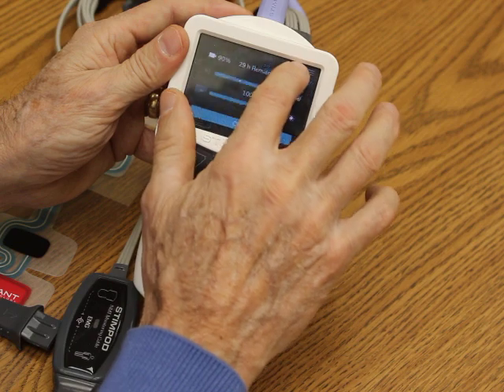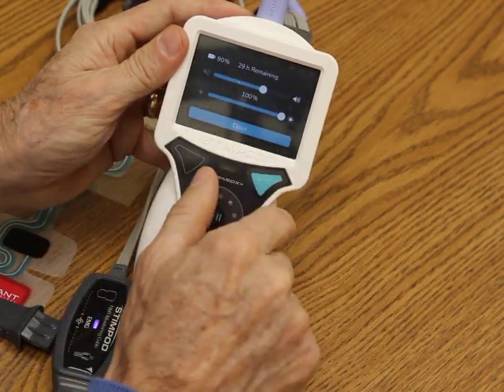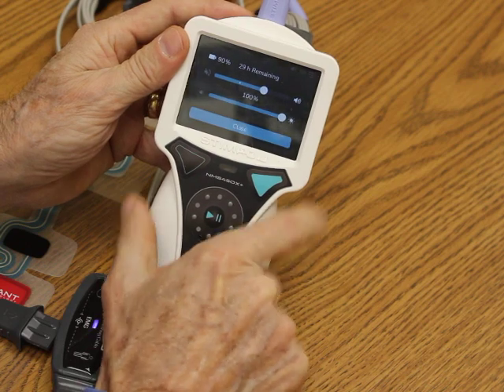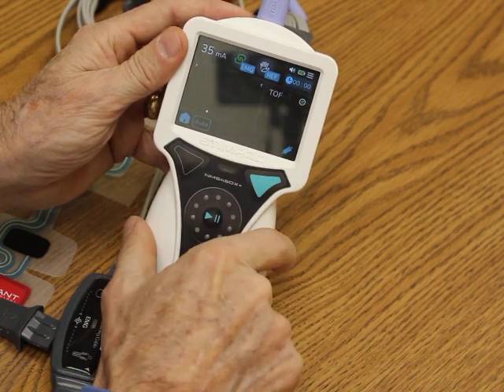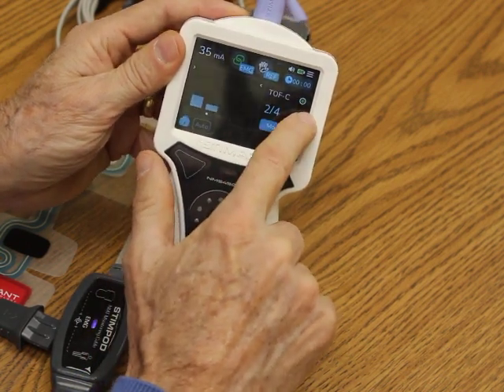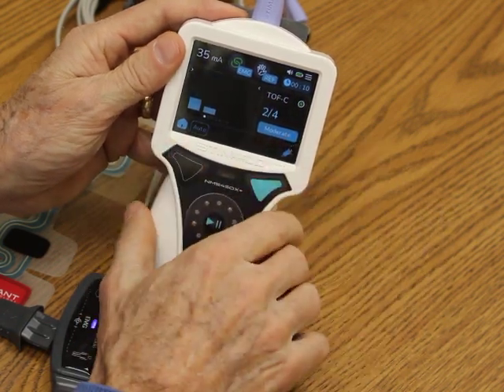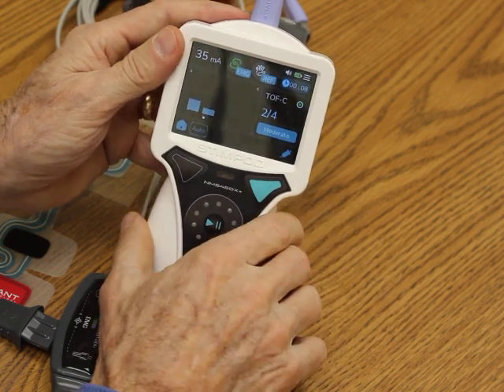I also have a battery indicator that will show me how much battery life remains. In this case I have 29 hours remaining — we have a 40-hour battery. I can adjust my screen lighting as well. This little green indicator shows that I am recording this information and storing it, and it will be ready to go to a computer or to an EMR.